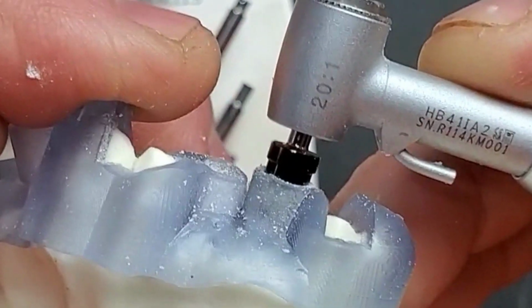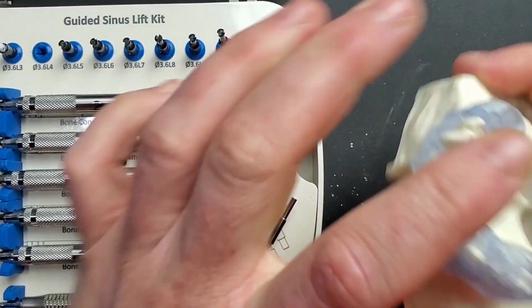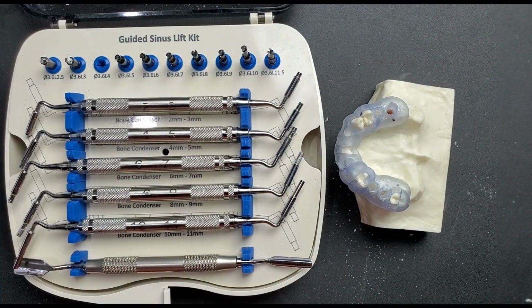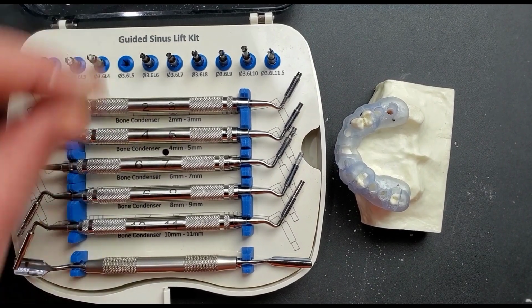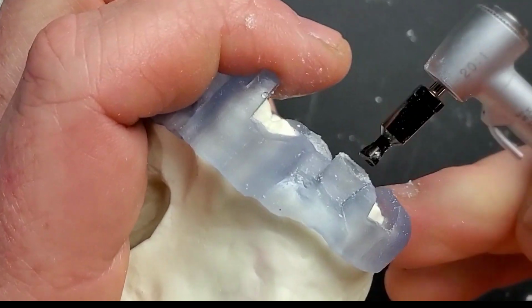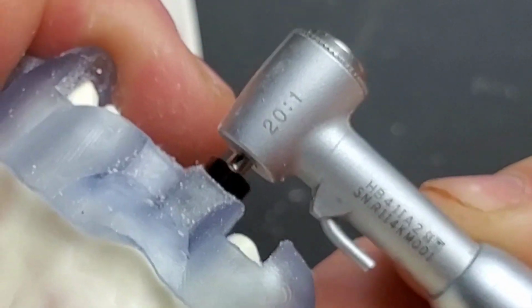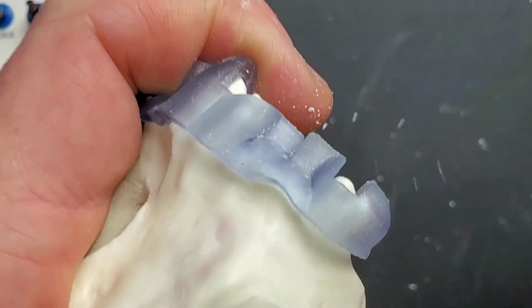And in that case, you would just step on the pedal, go another millimeter deep. Okay? We can grab now the next drill, which is a 5 millimeter, place it in. Without it running, you see that there's still a 1 millimeter gap here. So we step on the pedal. All right.